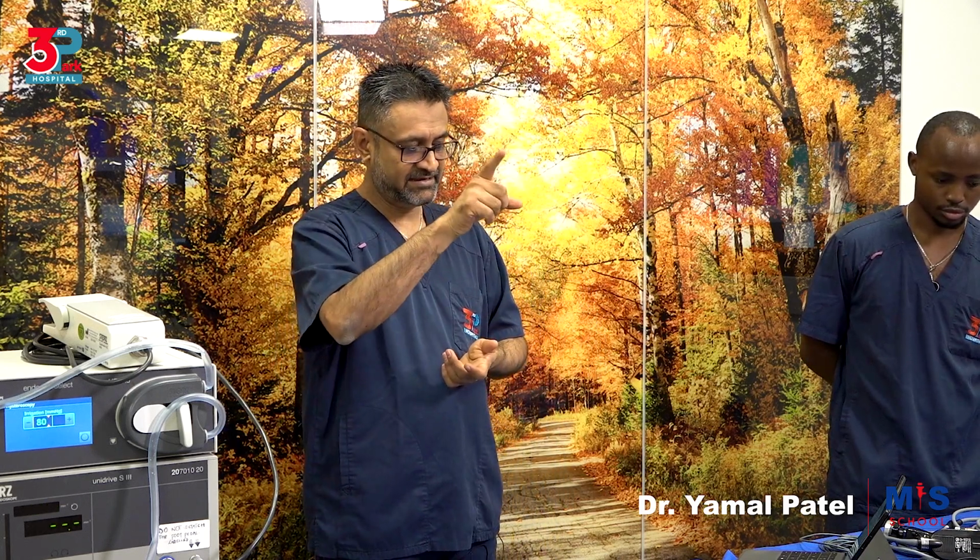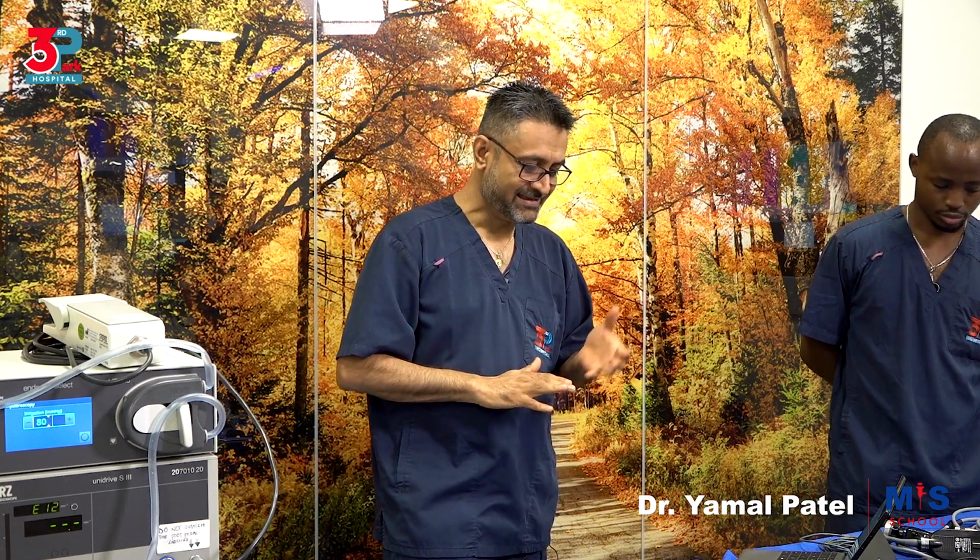Then we have the flexible hysteroscope, which is sometimes used in office hysteroscopy. There is a flexibility at the tip with deflection of up to 120 to 160 degrees. It is good in irregularly shaped uteruses and navigation around intrauterine lesions, but it has its limitations in the kind of procedures that we could be able to do. So this is about the telescope of the hysteroscopy unit.